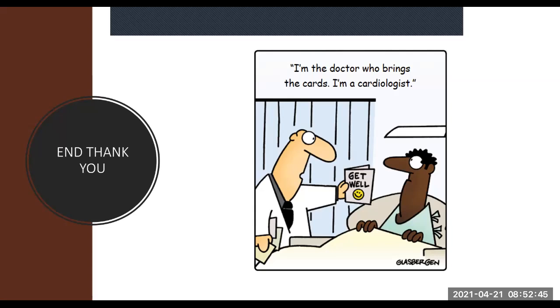So don't worry. But any questions, anything that seems a bit worrying, anything that seems a bit strange, now you know it is possible with our mission. That's the important thing, okay? And more or less what to look out for. Okay, not sure if there's any questions from the Zoom crowd or if everybody's happy.